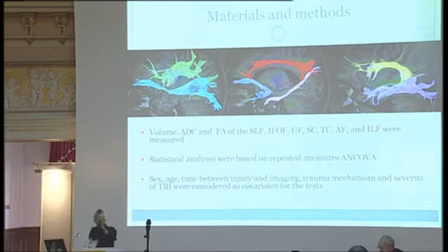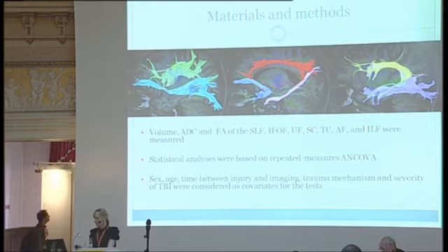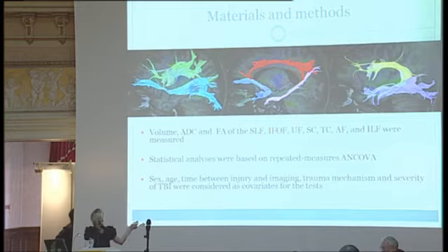We studied superior longitudinal fasciculus, inferior fronto-occipital fasciculus, which is blue there, and uncinate fasciculus, temporal superior and temporal cingulum, and arcuate fasciculus, which is yellow, and inferior longitudinal fasciculus.